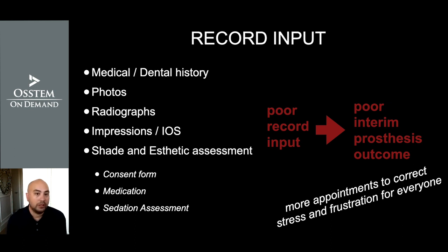A poor record input would inevitably lead to a poor interim prosthesis outcome, which means more appointments to correct the interim prosthesis, stress and frustration for everyone: for you, for your staff, and of course for the patient.